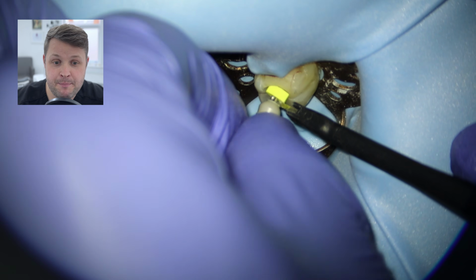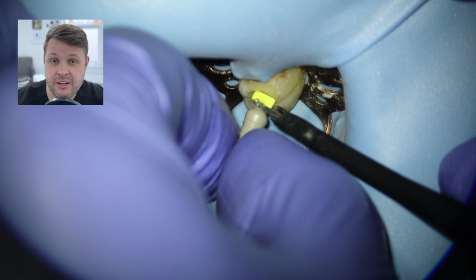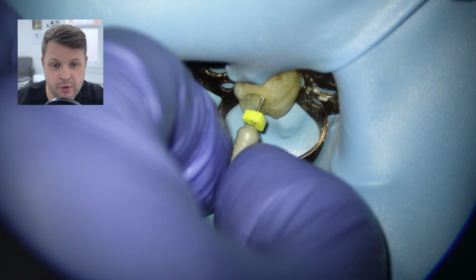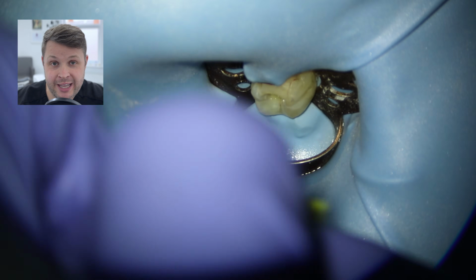And obviously it's important to know that the 8D finder is probably a little bit too small for us to gain an accurate working length. It's always a good baseline measurement, an accurate roundabout measurement to know where we're going with our hand files and our rotary files before we take the proper working length. And it's always important that when you drop past that point where you couldn't get past previously, is not to pull a file straight out.